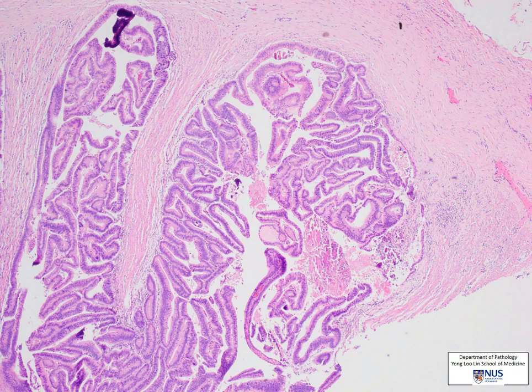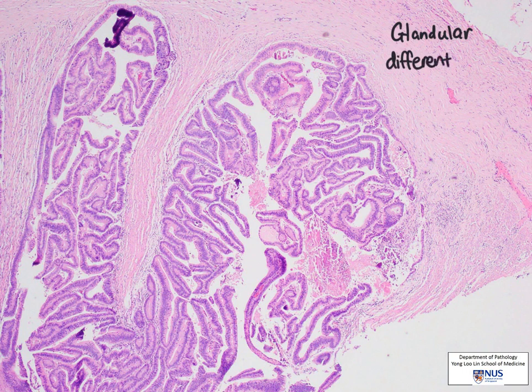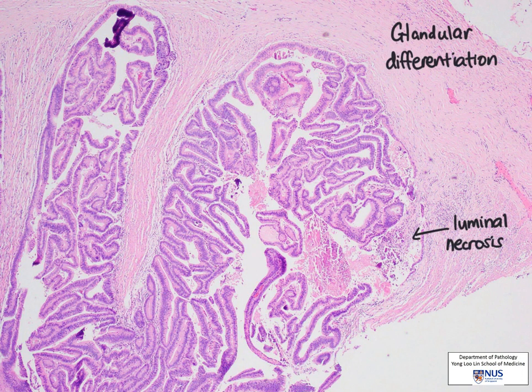Zooming into the tumour at medium power, it shows glandular differentiation, which is a feature of adenocarcinoma. The grade of this tumour is determined by the extent of glandular formation. There is also characteristic luminal necrosis associated with colorectal tumours.